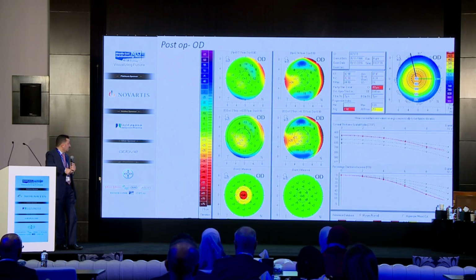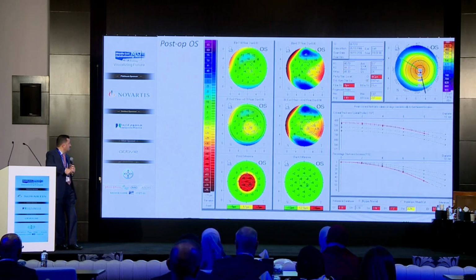Yes. See, in the right eye there was an elevation map. After the treatment, it's around +8, and after the treatment it becomes improved. And the left was like this, +11. And see, after your treatment also, it was much improved in the anterior elevation.